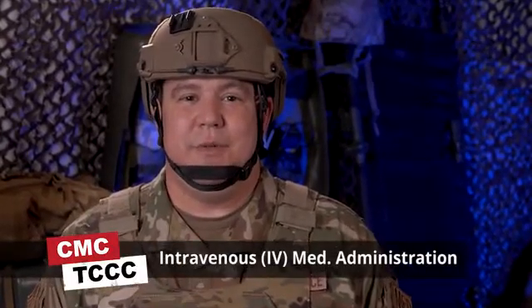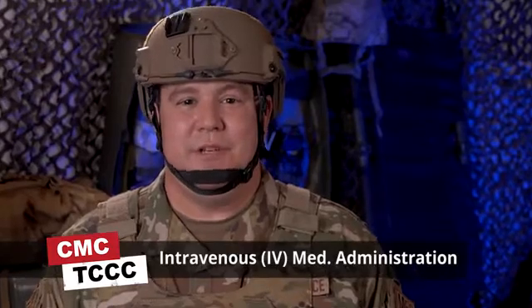Hello, I'm Adam, an active duty Air Force medic. I'm going to teach you the procedures for administering medications via the intravenous route.